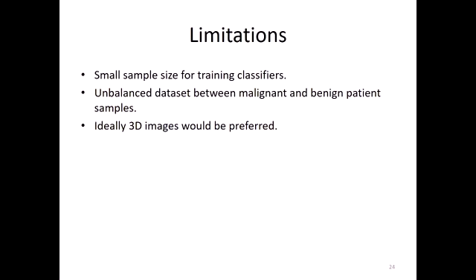And if you read the literature, some say that 2D and 3D don't make a difference, and some say that 3D is better than 2D, and it depends on what study you're doing. In the feature extraction and classification realm, most papers for prostate cancer, and I've even seen a lung cancer paper and a brain tumor paper, say that 3D is better. And these are the papers that have compared them side by side with the same methods and come up with 3D is better. It'd be nice to have those, and then we could do a 2D, 3D comparison.